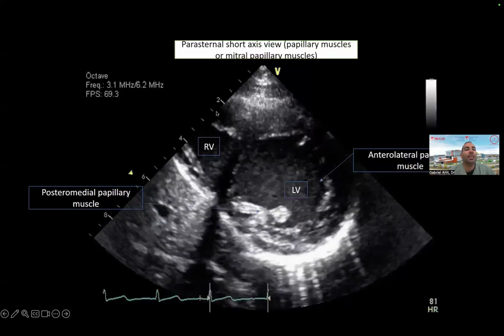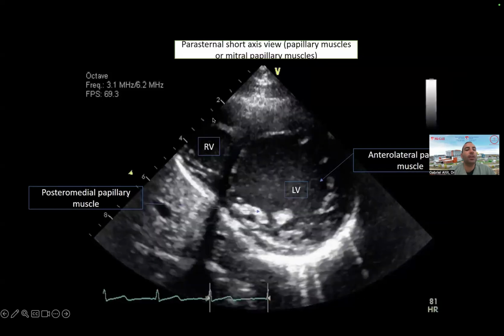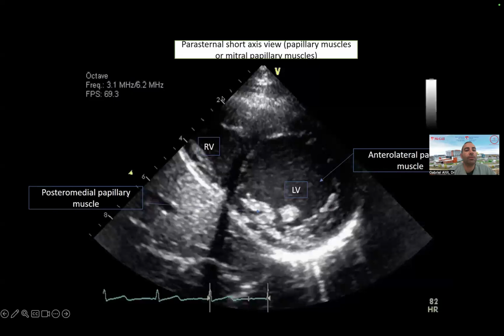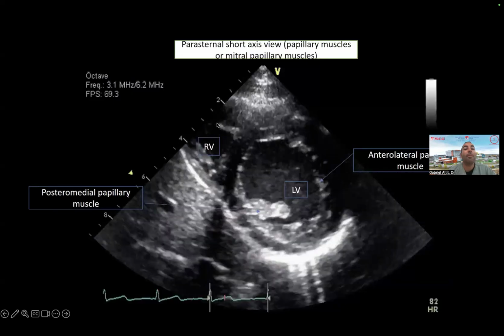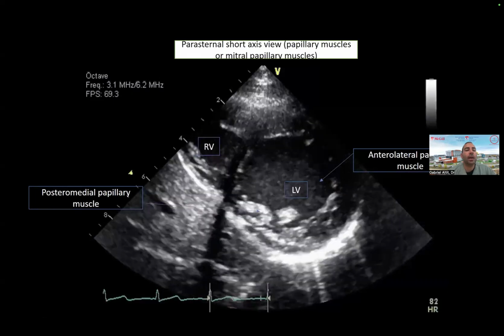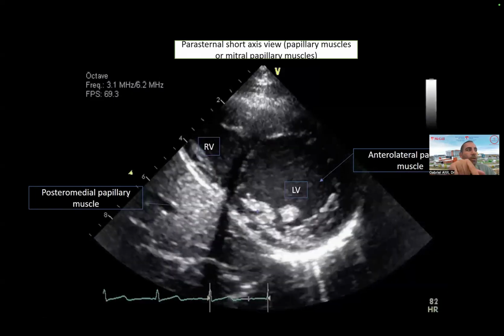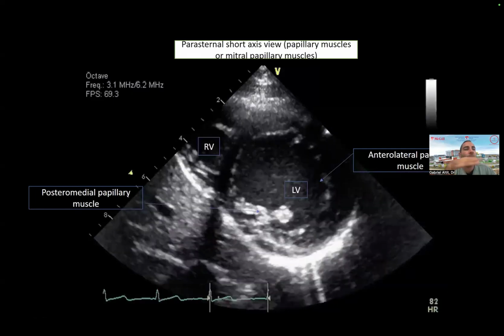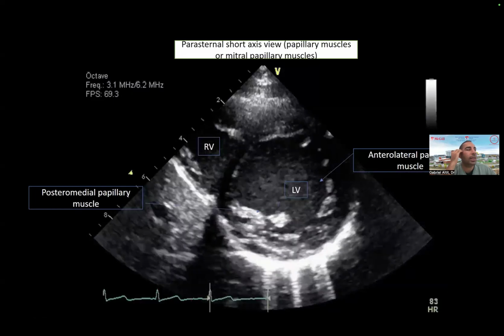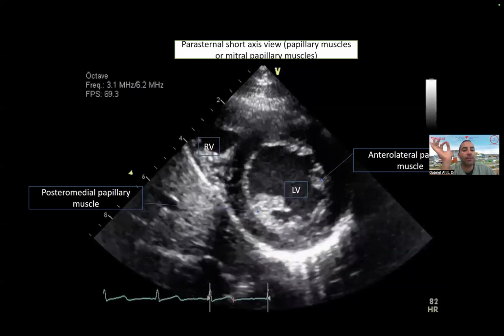The other thing you see here, this big muscle here is called what? In the middle of the RV cavity, there's like a muscle, bande modératrice, the moderator band. So there's a nice morphological section in the Neurocardio Lab website, which talks in depth about what's an RV and what's an LV. Moderator band often defines the right ventricle. LV will not have a moderator band.